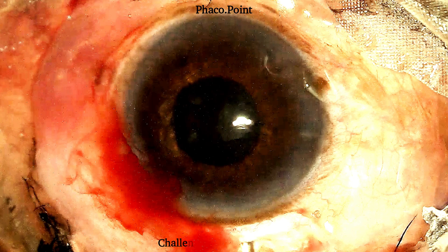When faced with a situation like this, the challenge is of limited visibility. You are unable to see beyond the iris, and therefore removal of the cortex with a SIMCO is going to be challenging. Moreover, if you were to use the SIMCO via the main incision, you are also likely to have an unstable anterior chamber, which increases the challenges that you would face.